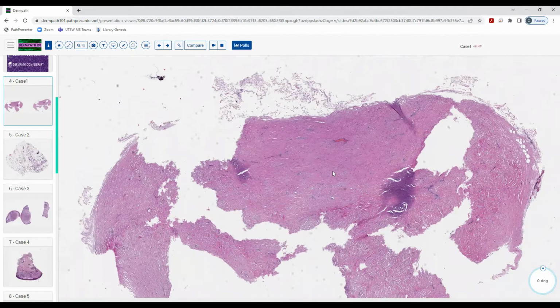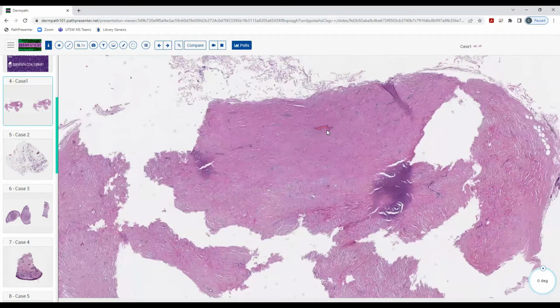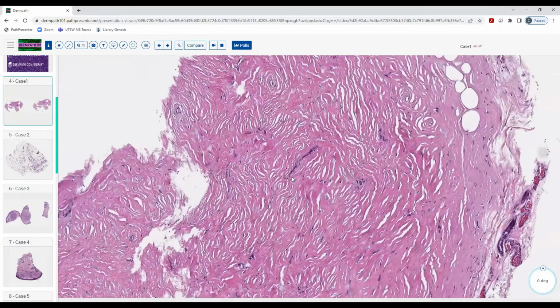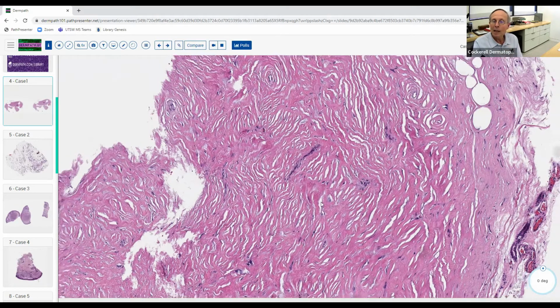So it's a fragmented piece of tissue, but I didn't think I saw epidermis from what I'd seen, but it looks like it's probably dermal area, but it has this sclerotic or collagenous appearance with these clefts, like it almost looks like vessels, but I don't think any of them are vessels. And we see some fat there, so it seems like it's maybe some neoplastic entity that's going into the fat. Yeah, I think that's right. I think it's probably a dermal based process, a nodule. And yeah, so I think it's a neoplasm.